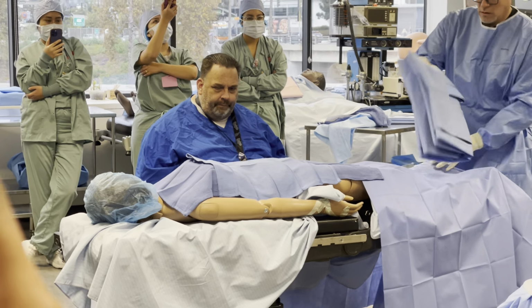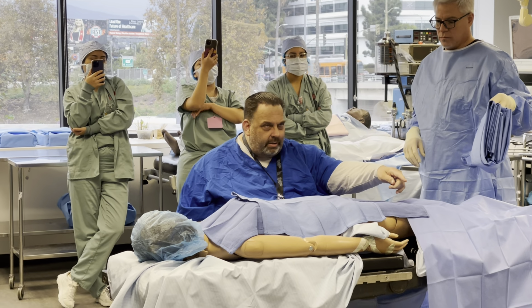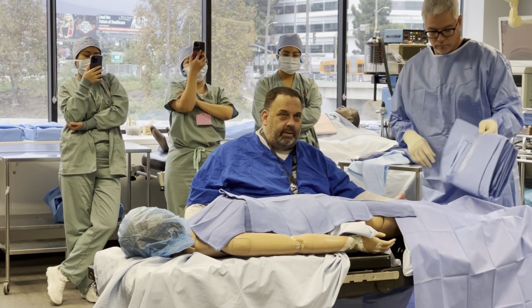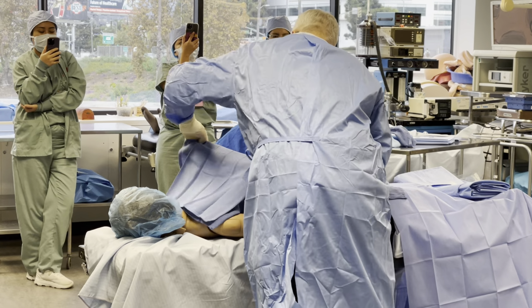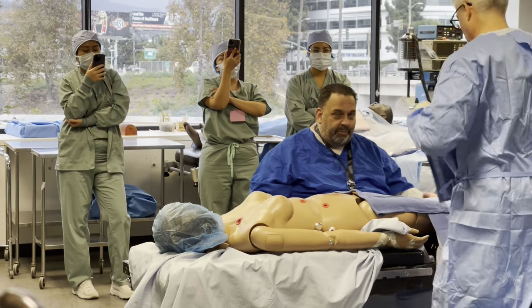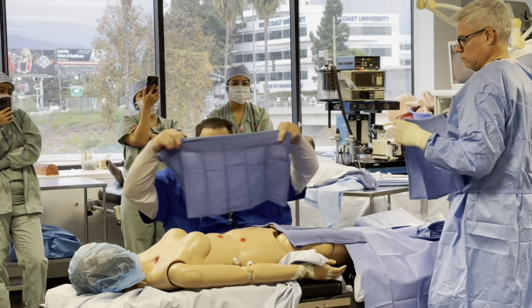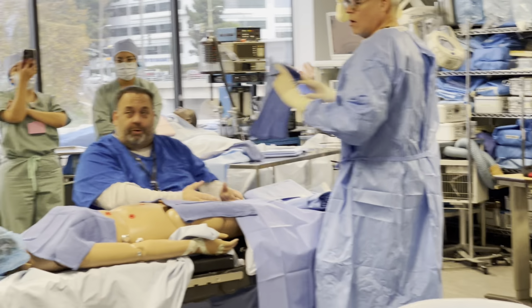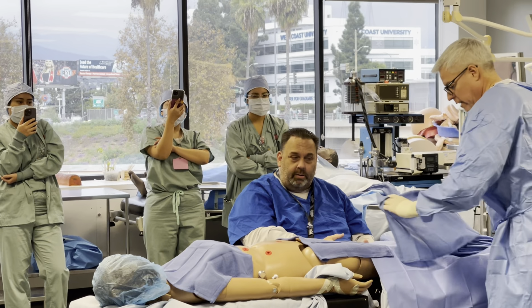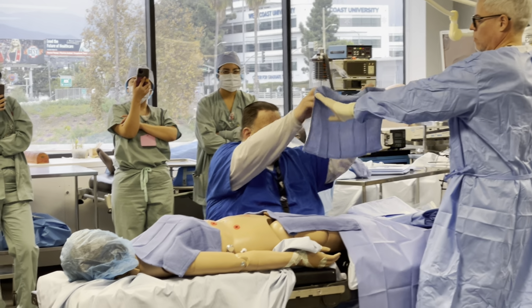Okay. Now, if it had been the other way around, he would be standing over here, passing across this field here. So, in the real world, you're gonna stand across from me. Okay? Same thing's gonna happen. We're not passing over the body, are we? We're passing over a sterile field we created. Also, you don't want to drag it to the patient, to the doctor. You never drag your towels. It's up, over.